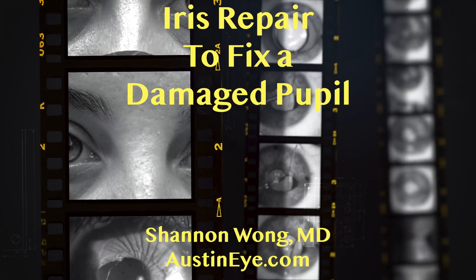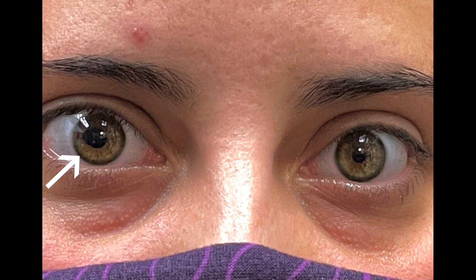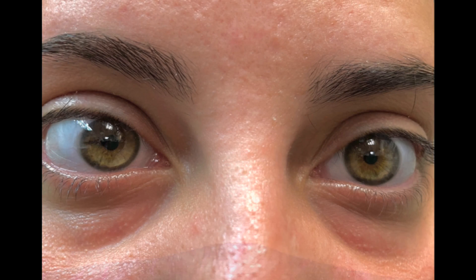Iris repair to fix a damaged pupil. How can we make a pupil that has been damaged and that has an irregular shape more normal? Let me walk you through the process.